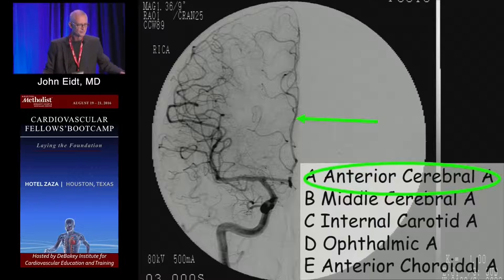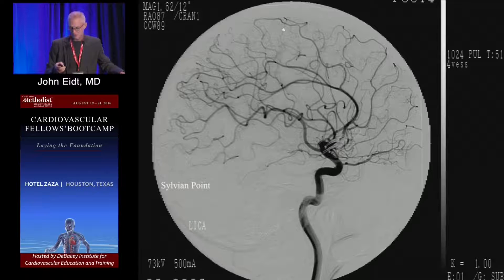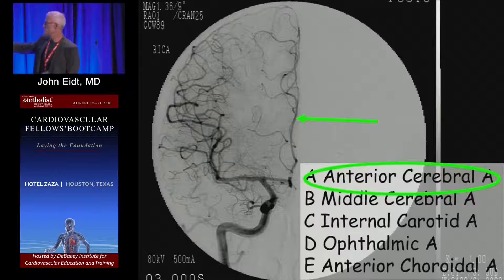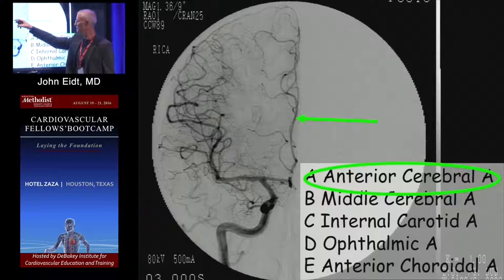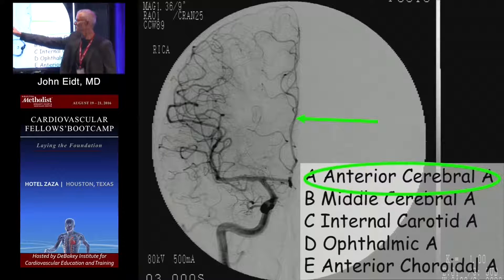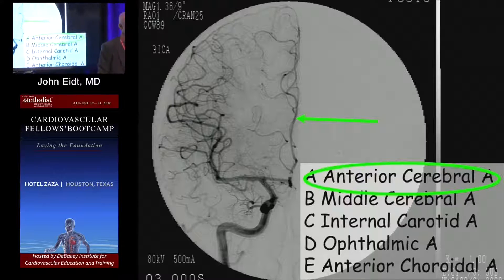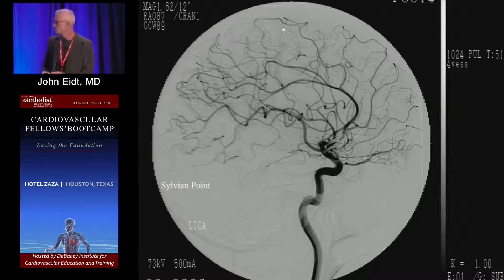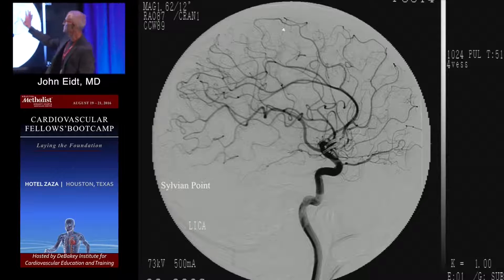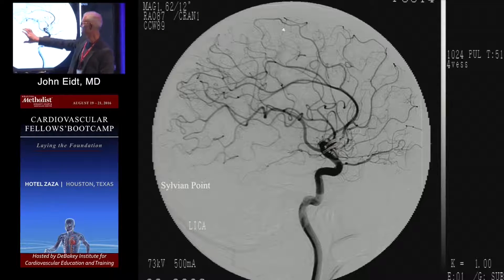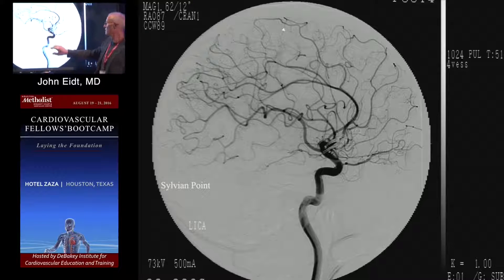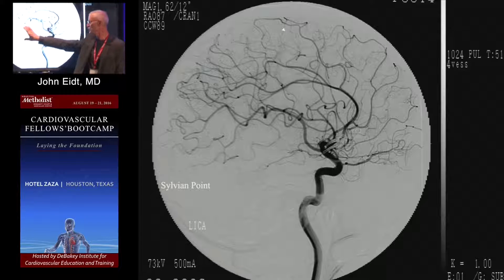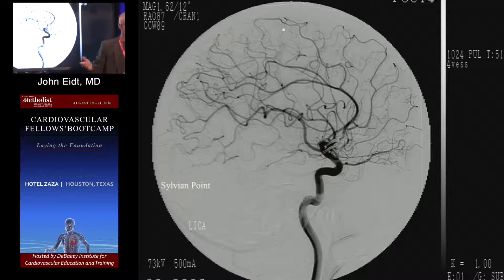Anterior cerebral. One thing to notice on this picture is there's not much in this space — it's basically kind of empty here. When you inject the anterior circulation, you see the middle and the anterior cerebral. You don't really see the posterior cerebral. From the side view, same issue — anterior cerebral here, middle cerebral here, there's a gap. Nothing is showing up there because this is normally feeding off the vertebral artery. If you see a lot of posterior circulation, you know you've got some vertebral disease.